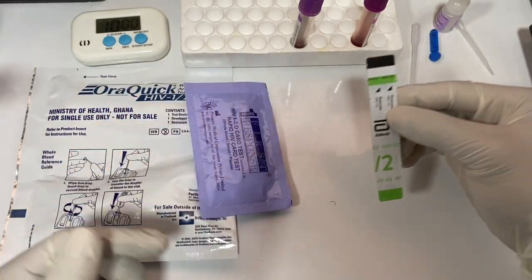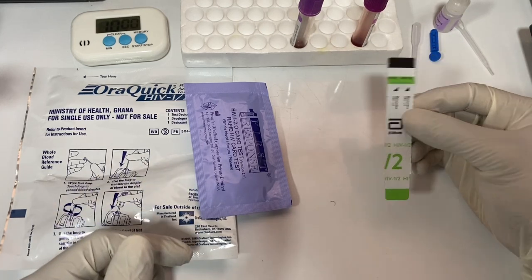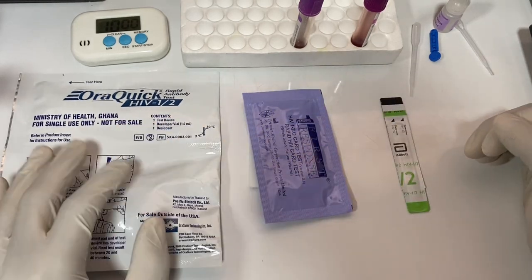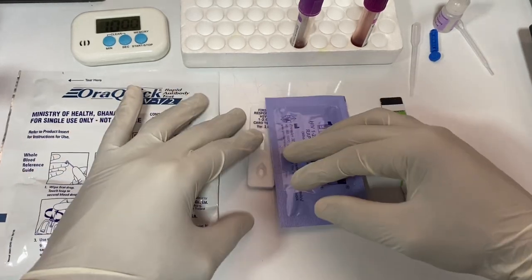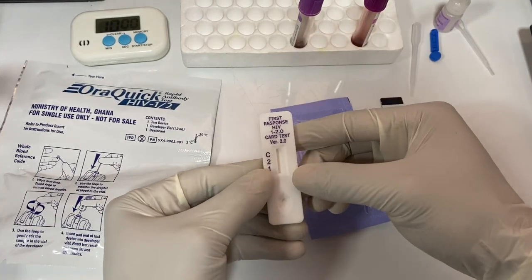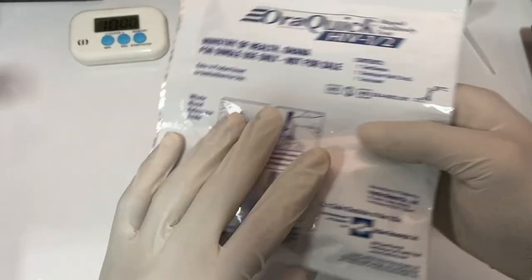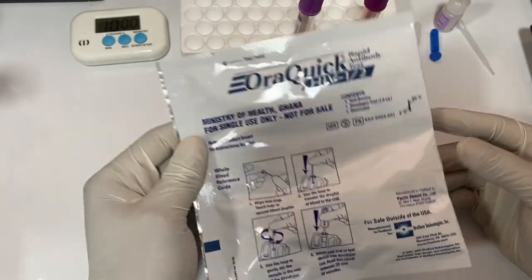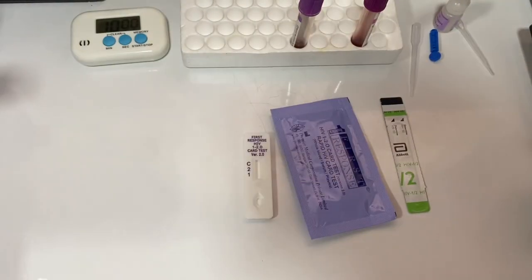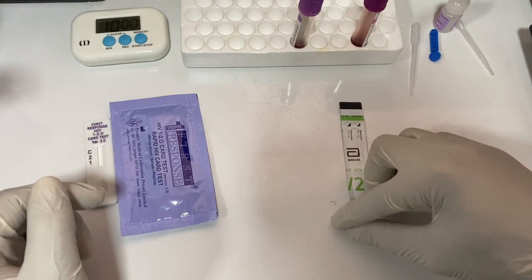The Abbott one will just develop one test line, so it wouldn't really differentiate between the two. Then we have this other one which is able to differentiate between 1 and 2. As you can see here, we have the test line for one, the test line for two, and then the control. We also have the OraQuick — we'll learn how to use that in this video too. For now, let me put the OraQuick aside and start with the Abbott strip.